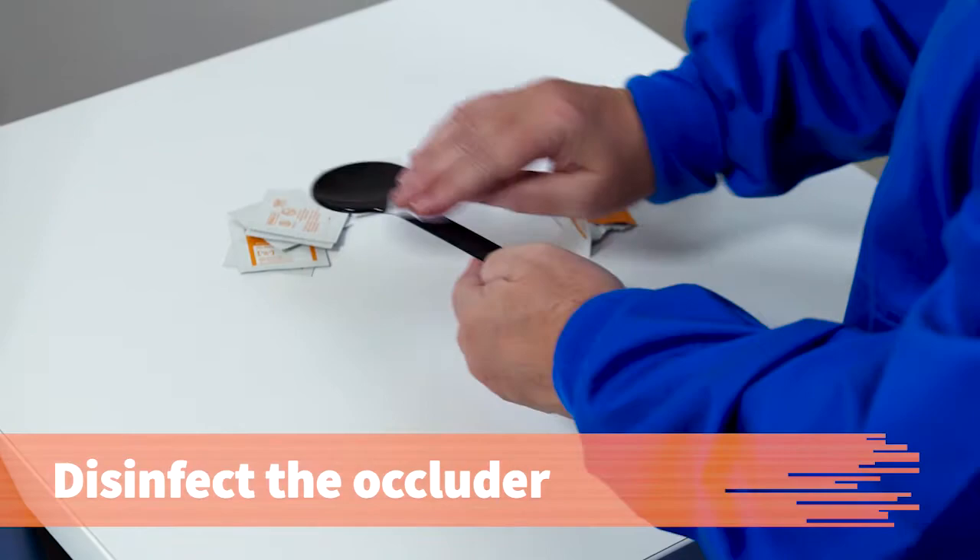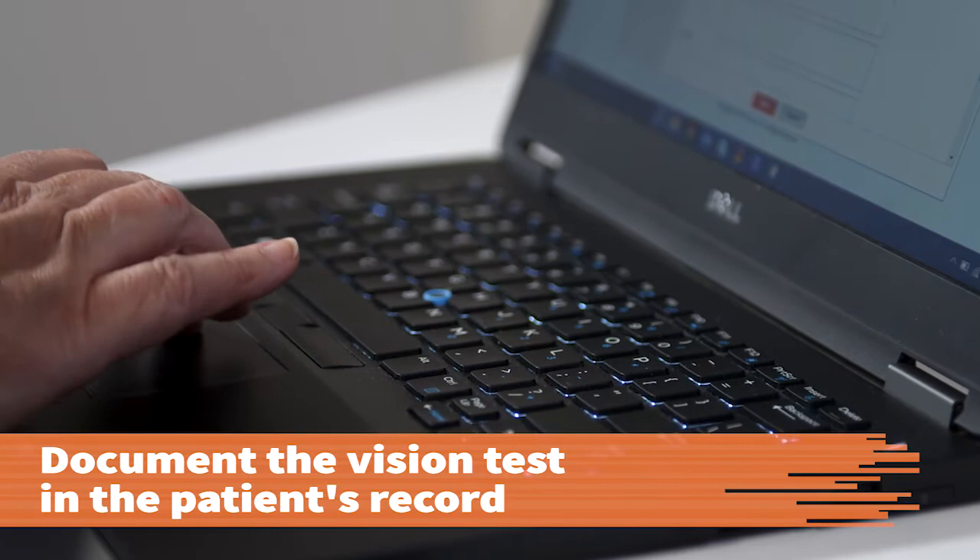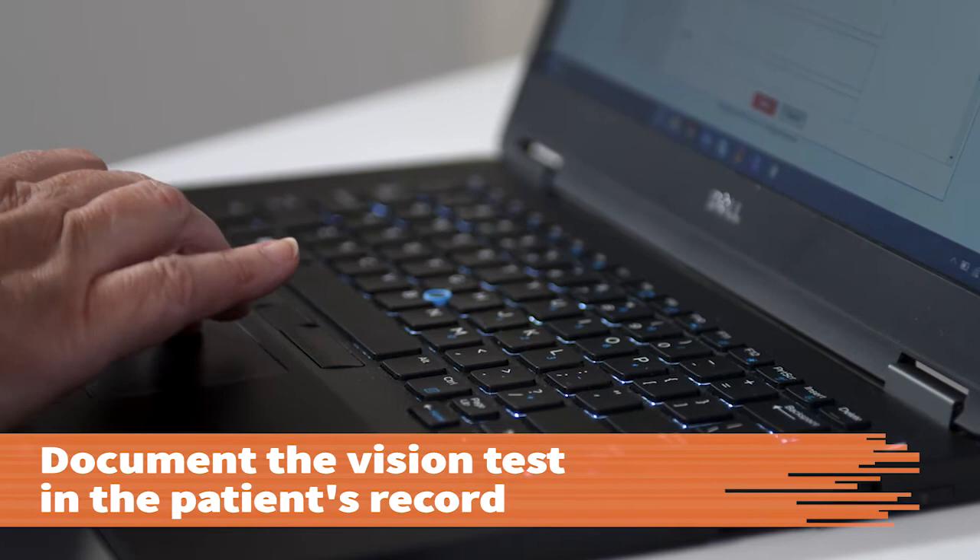When you are finished, disinfect the occluder with an alcohol wipe if it is not disposable. Sanitize your hands again. Document the procedure in the patient's record, including the date and time, visual acuity results, and any reactions by the patient. Also record whether corrective lenses were worn. Procedures must be documented to be considered complete.